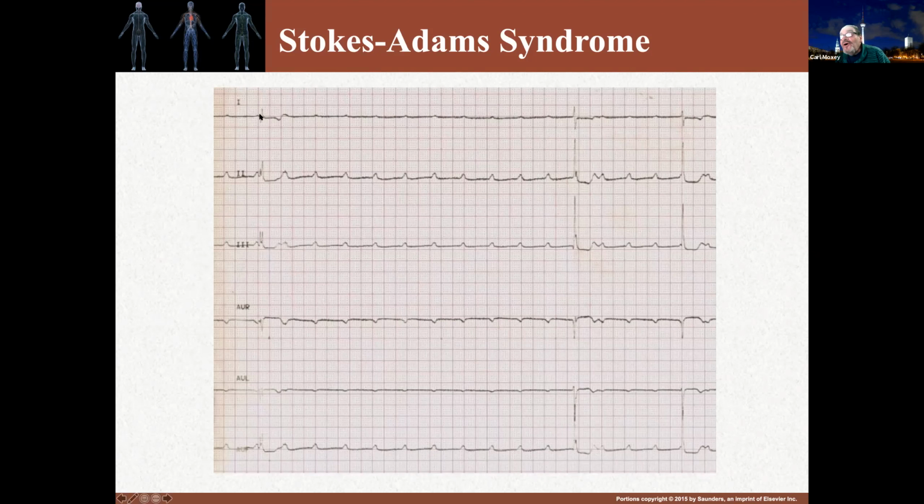Notice here's QRS, T wave, nothing, nothing, nothing. QRS. A few more P waves before we get another QRS. This is not a happy way to live.